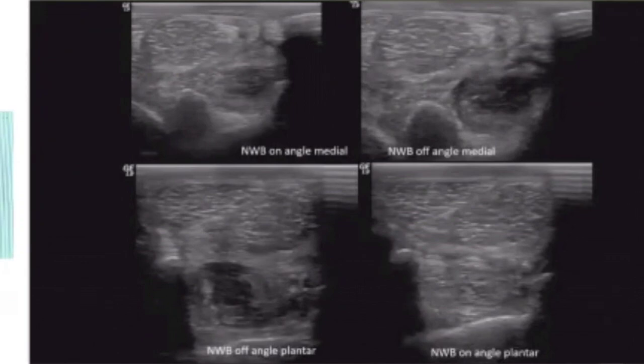So this is just, again, an assortment of suspensory ligament injuries or suspensory ligament angles. When I scan the suspensory ligament, I do the majority of it non-weight bearing, and I look at it on angle and off angle from a medial approach and from a plantar approach. So here I'm coming in from the medial side, running underneath the chestnut. Here I'm coming from straight plantar, on and off angle.